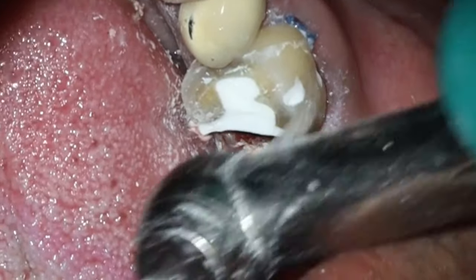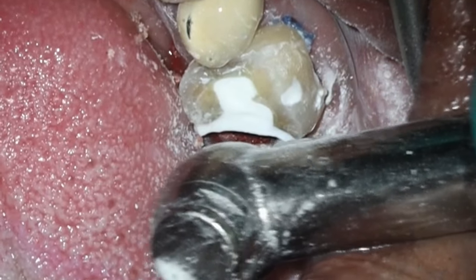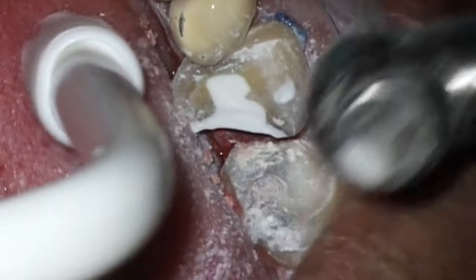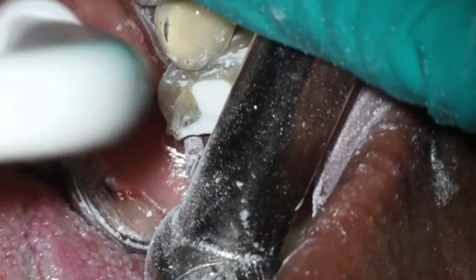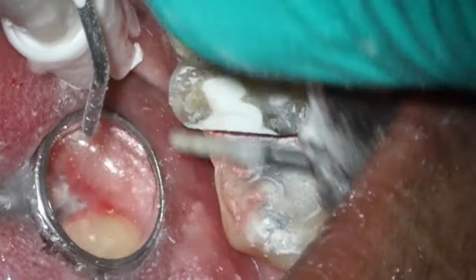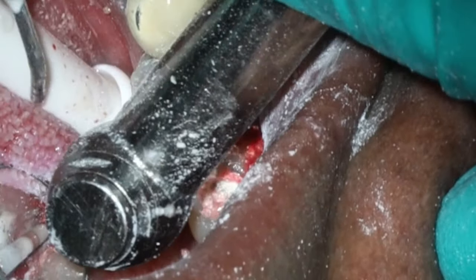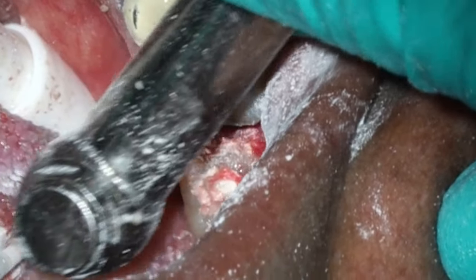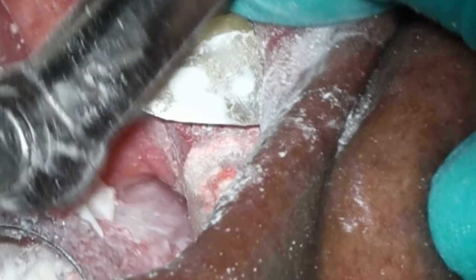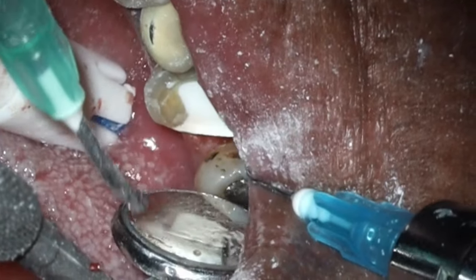Sometimes with these large cases I'll turn the diamond sideways to create just a little bit more smoothness — if you keep it vertical you have more of a risk of gouging. So turning it sideways and polishing everything to keep it looking nice and hygienic. On deep cases where the dentist is trusting you to do the restorative, you want to do it better than them — that's the key to getting approval for doing restorative: be extremely good at it, make their lives easy. Don't send back something with voids. Doing beautiful restorative has been one of my biggest practice builders.